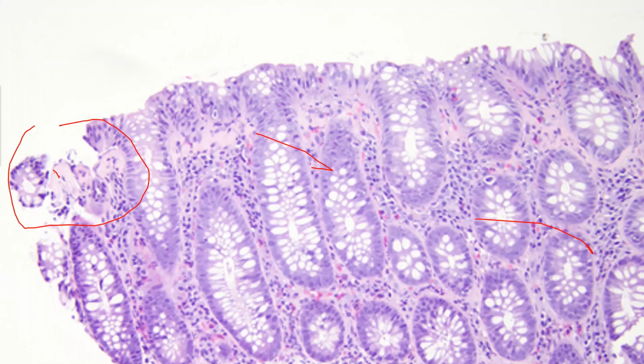And this is when the measurement comes in handy. They say if it is above 10 micron, then this is a thickened collagen. Can you see how focal that can be? But can you see as well that the epithelium is stripped? It's coming off, right? So it is just telling you that even on a small biopsy, this is a very difficult example.